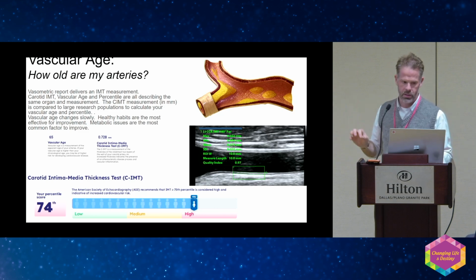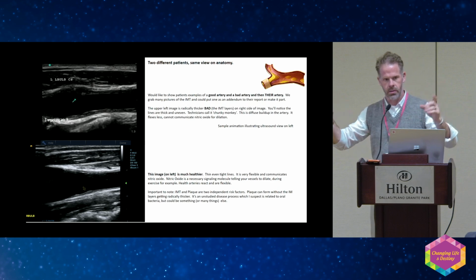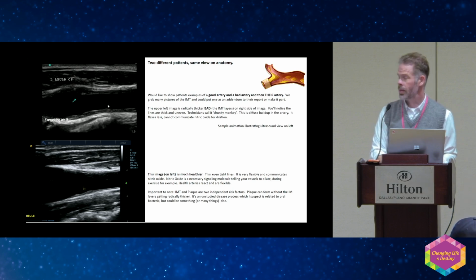Vascular age is just inflammation. The plaque is a different animal. The plaque is the burdening of the arteries, those blisters, those plaques forming. On the bottom left, you can see some very small plaques forming on this patient. On the bottom upper left, this is diffuse, thickened intima. All of this is over 1 millimeter. This patient's artery doesn't flex very well, doesn't move very well, it's not very responsive. Guy probably has erectile problems.